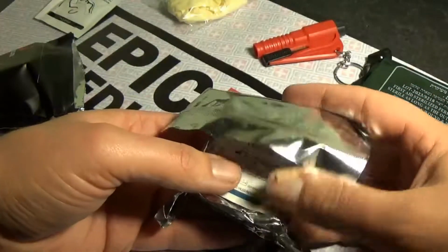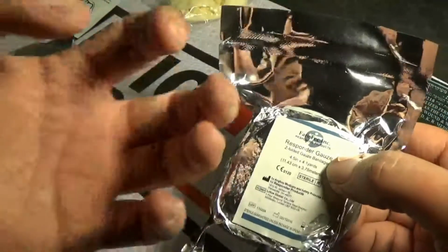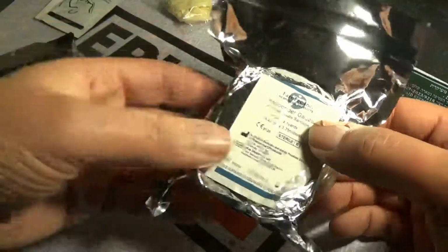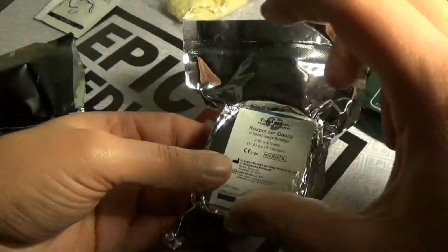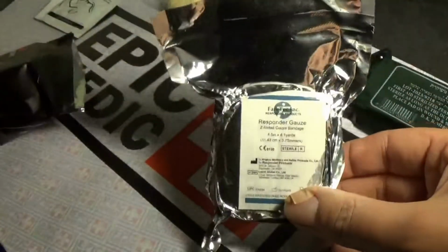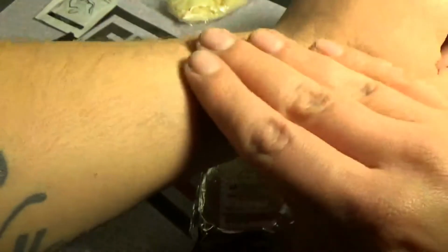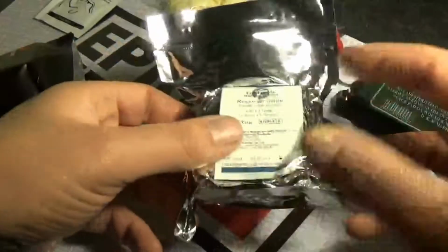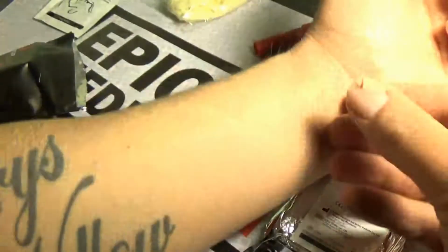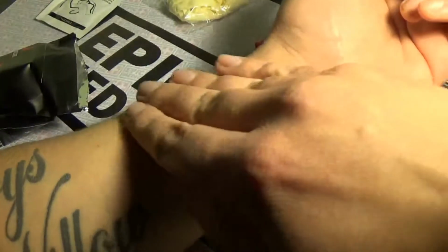press this into a wound, which is known as wound packing, it starts to absorb that blood and it helps the body actually clot. So really smart, and it can also aid with the pressure as well. Just to give a quick example, I have a large cut to my arm here. What I would do is get the Z-fold gauze and start to feed it into the wound and keep pressing down, keep pressing down, keep pressing down.